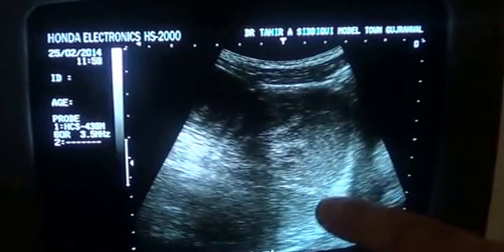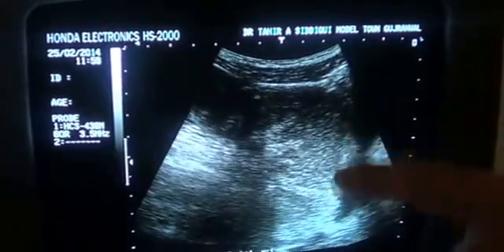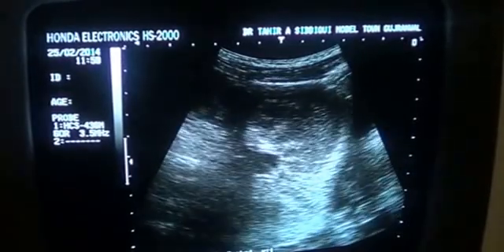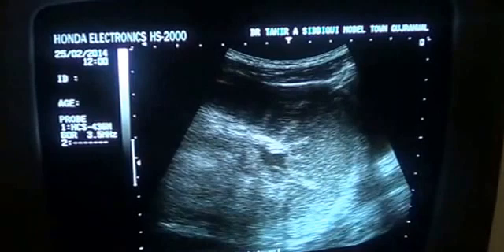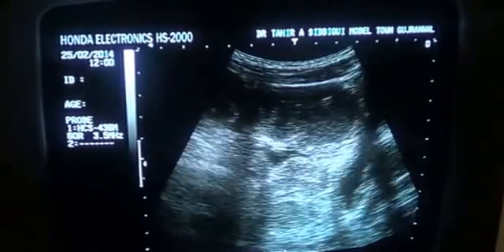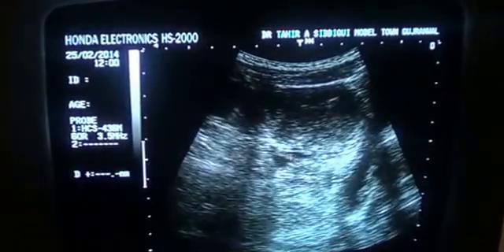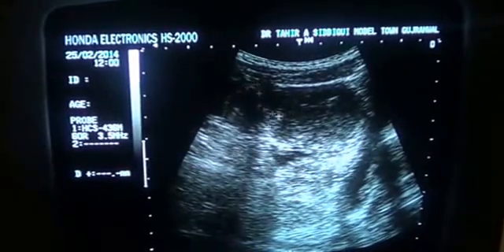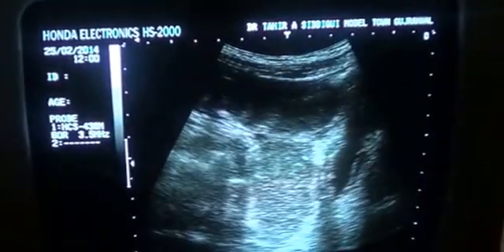You can see the movement of fluid within these distended bowel segments, as well as interbowel interlope ascites. This is fluid, this is a bowel segment — all of these are bowel segments. You can also see a small amount of fluid in this region.